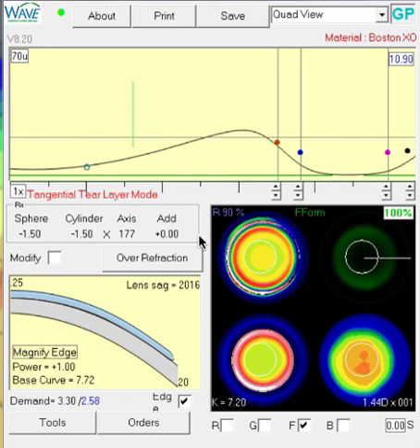So with ortho-K, we do expect to correct about half, so maybe be left with 0.75. One is not too far from that. Sometimes we get a little bit more, in which case we celebrate. Sometimes we don't get the full amount. And so if we are plateauing at pretty close to half, we're probably not going to get a whole lot more treatment by giving the patient more time. So I would go ahead and make some changes to the lens at this point.